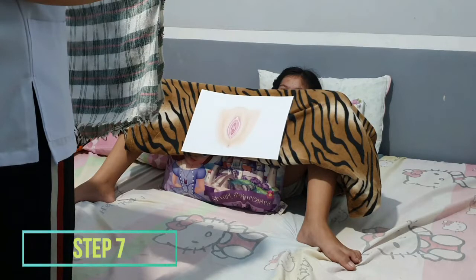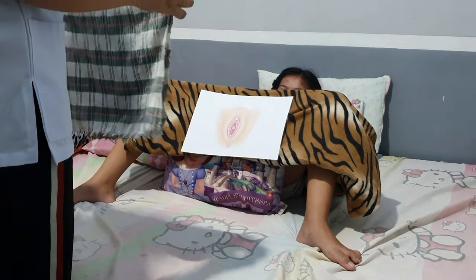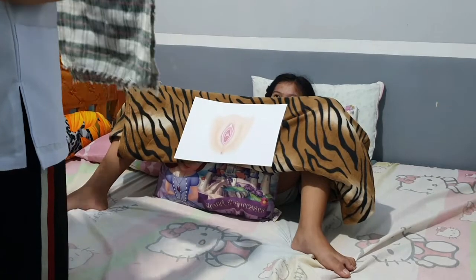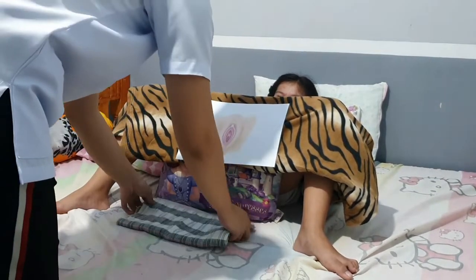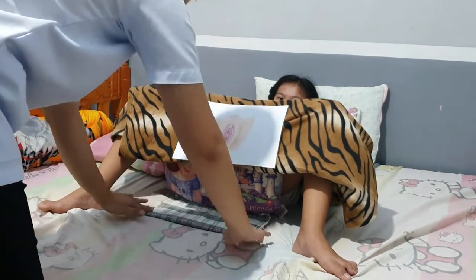Place a waterproof pad under the patient. Position the patient depending on gender. Place a blanket or sheet to cover the patient and expose only the required anatomical areas. Okay, ma'am, I am going to put a waterproof pad underneath you, okay? Assume that we already washed the perineal area with warm water and soap. Ensure adequate lighting for better visualization.